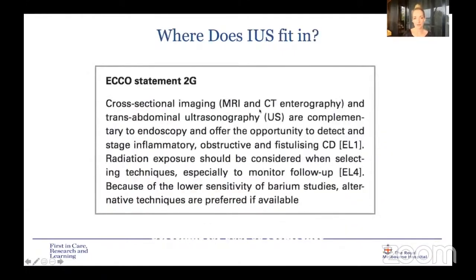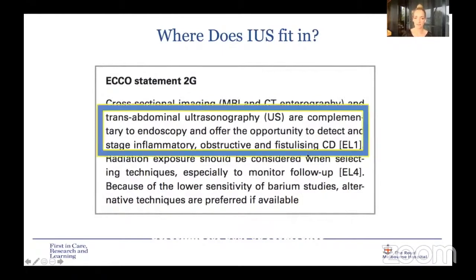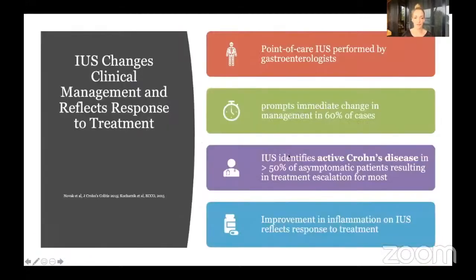So where does intestinal ultrasound fit in? Well, the ECCO statements say it can be used along with MRI and CT as a complement to endoscopy and clinical assessment to detect and stage inflammatory, obstructive and fistulizing Crohn's disease. It's really important to note that intestinal ultrasound changes clinical management and reflects response to treatment. As I said, once you start using it, it transforms your care. We are all moving to a treat-to-target type management with our patients, and this is a really great non-invasive way to monitor our patients and make sure we're actually treating them that way.